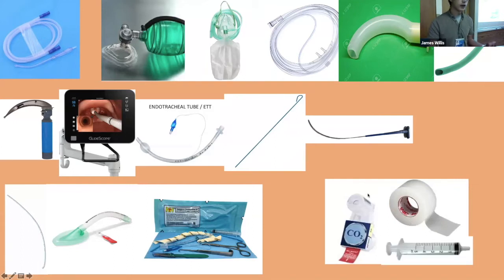And you want to make sure that all your equipment is ready and working beforehand. So make sure you inflate the cuffs beforehand, check the blade lights, have the video laryngoscope plugged in and working, make sure the suction and oxygen are also working.